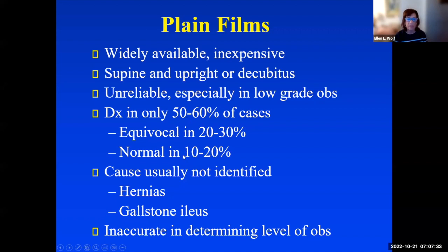In addition, plain films generally cannot identify the cause of small bowel obstruction.